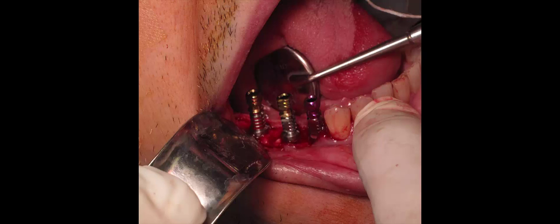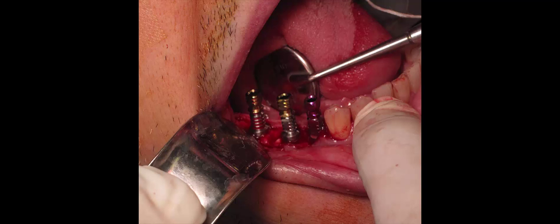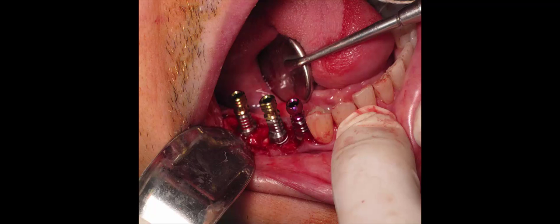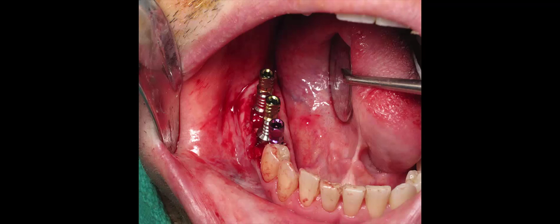A slightly graphic image, this is the surgery on the right side with the three implants and the bone exposed.